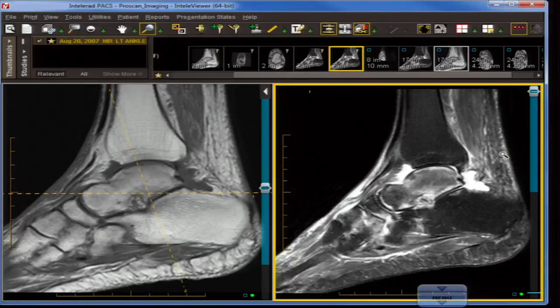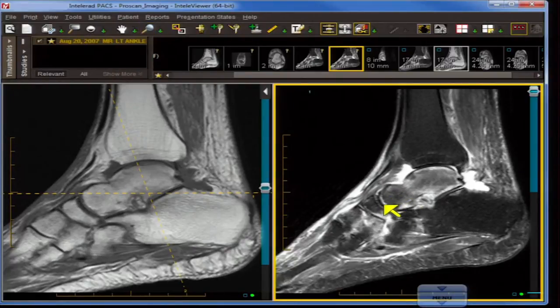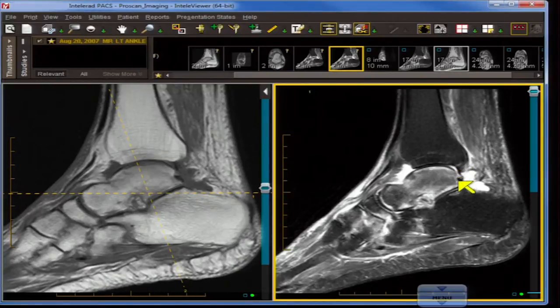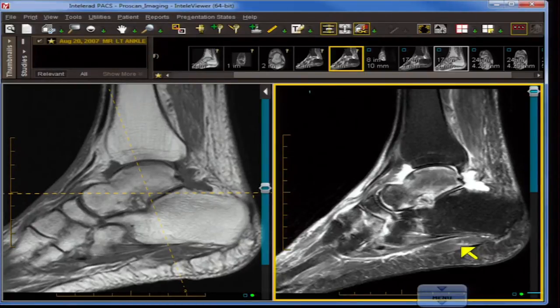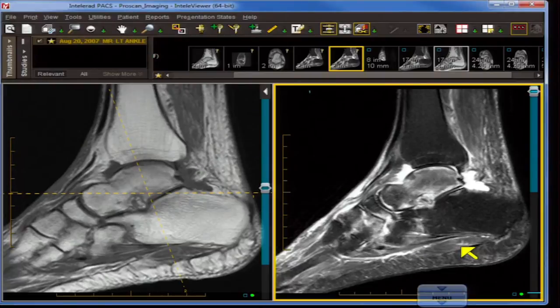The most likely diagnosis is A — now more recently known as complex regional pain syndrome, but previously known as reflex sympathetic dystrophy. It is the most likely diagnosis due to the peripheral osseous edema seen here in a picture frame pattern, as we're pointing out with the cursor — subcortical and predominantly in location with very high signal. Overuse-associated osseous edema is usually patchy and non-juxta-articular in distribution. Regional migratory osteoporosis demonstrates diffuse osseous edema due to rapidly increased osteoclast function. Answer D, microtrabecular fracture, is usually associated with diffuse or focal osseous edema.